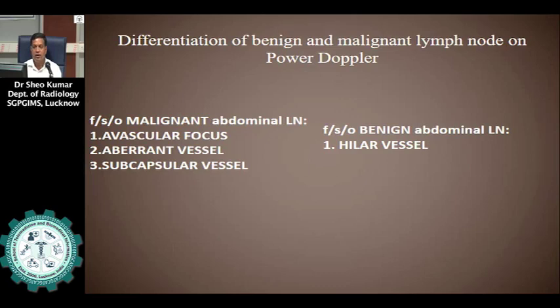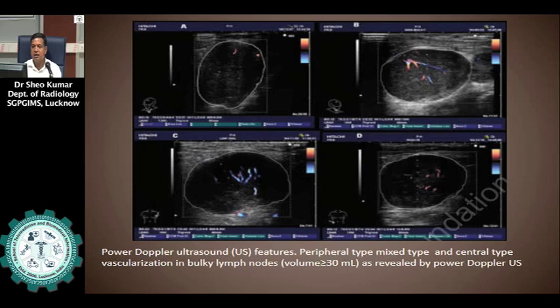Differentiation of benign and malignant lymph nodes on power Doppler: points in favor of a malignant abdominal lymph node are avascular foci, aberrant vessels, and subcapsular vessels. The point in favor of benign abdominal lymph nodes is hilar vascularity. Power Doppler ultrasound shows peripheral type, mixed type, and central type vascularization in bulky lymph nodes.